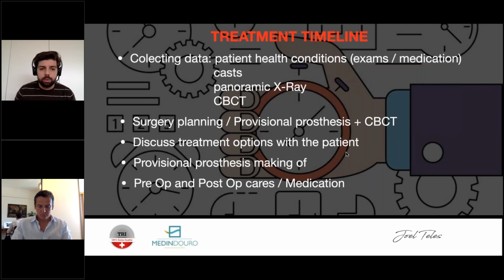Don't go looking at bone, trying to understand what's the right approach with this bone, because in some situations you'll end up cutting a lot of bone in order to be able to put the teeth in their right positioning. People don't pay you for bone, they pay you for teeth that look good, that don't get transition lines exposed. Consider this is a prosthetic treatment. Again, it's always about prosthesis.